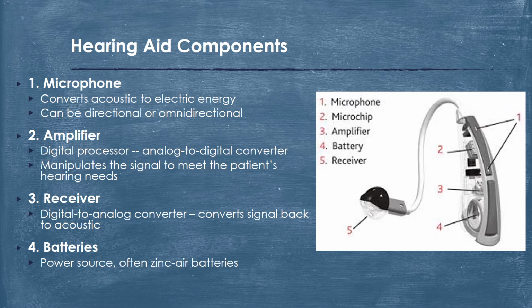And the battery type is dependent on the size of the hearing aid. For example, smaller batteries, such as the size 10, which comes in yellow packaging, are for smaller hearing aids, whereas some of the biggest behind the ear hearing aids are run by a kind of a disc-shaped 675 battery that has blue on its packaging.